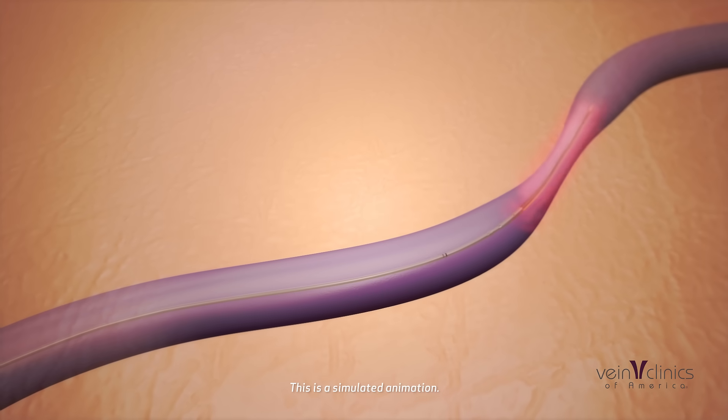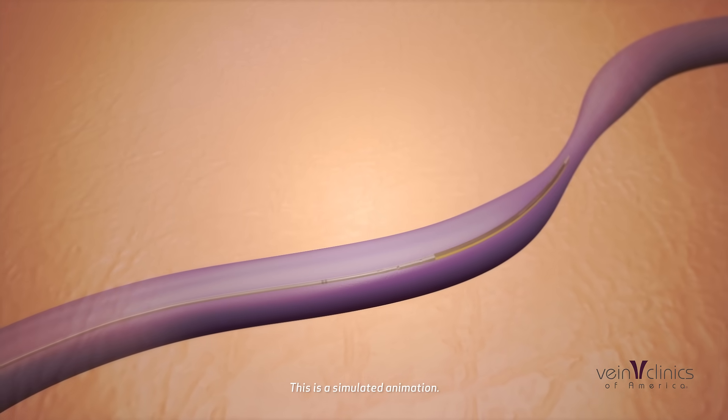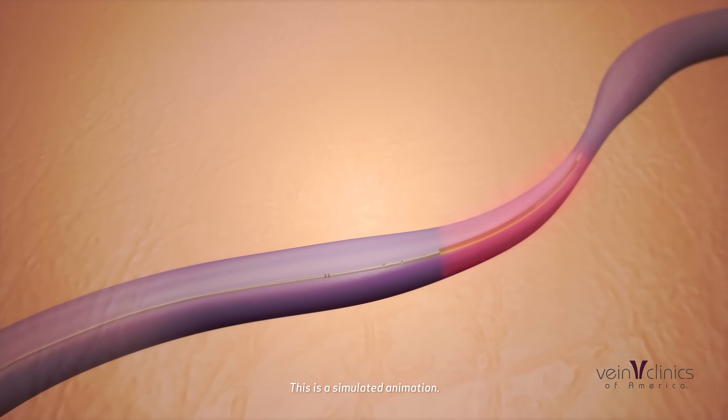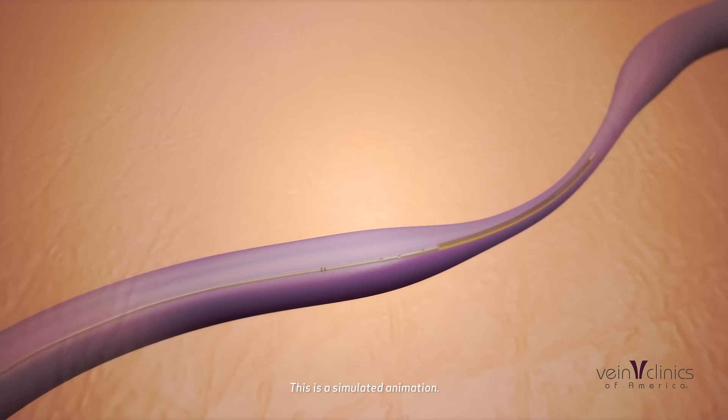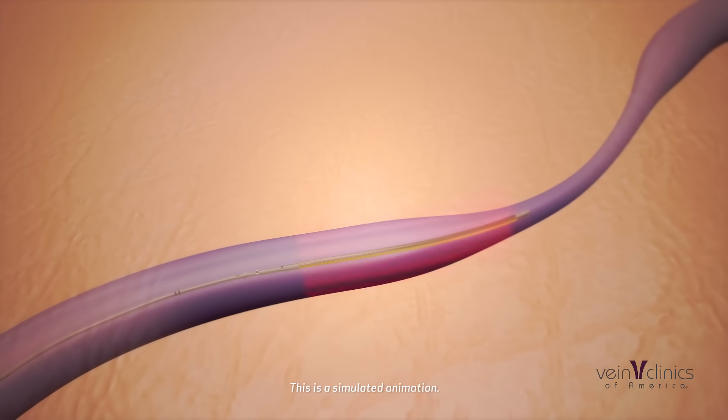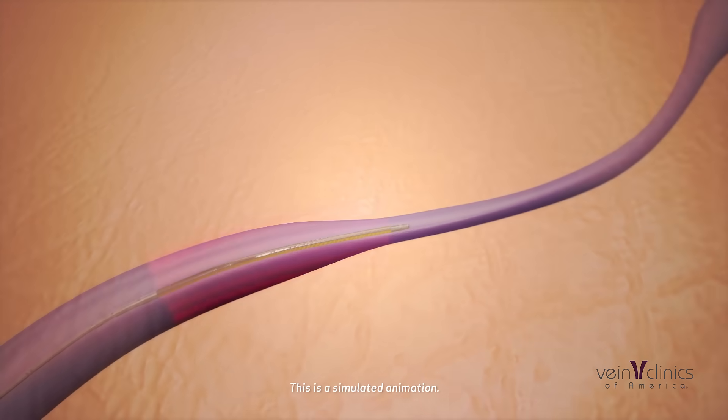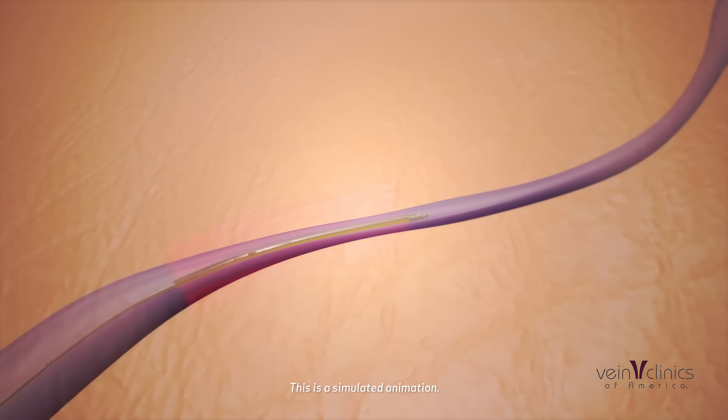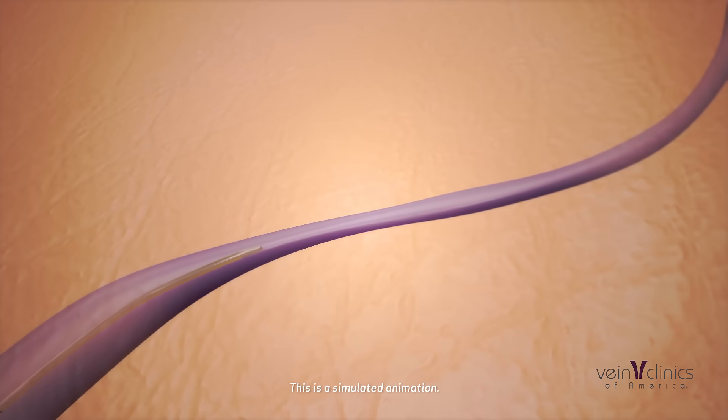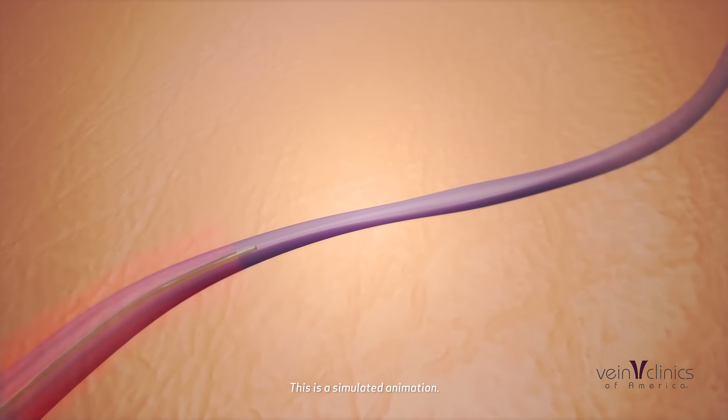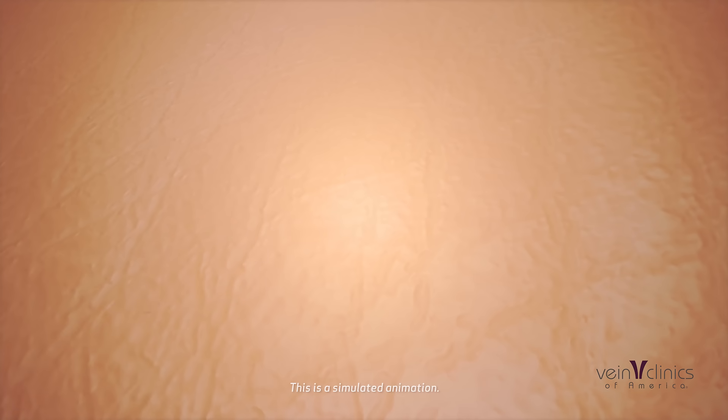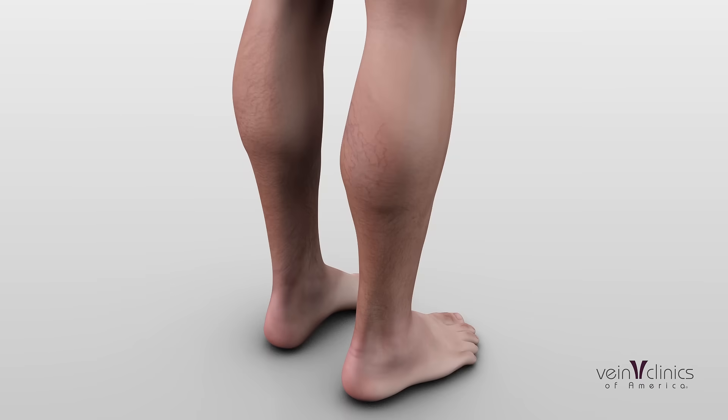Once the vein is collapsed, it is eventually absorbed by your body. Afterward, the blood flow is diverted to healthy veins, improving circulation.